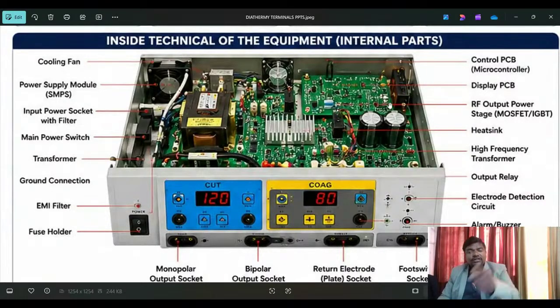Otherwise, if you do this service repeatedly, you are a skilled engineer, but after providing many services, they simply say the feedback is negative, because complaints keep coming, sir, but actually the problem is their electrical issue, and they don't know, and they don't want to know also. That time you have to make a report.